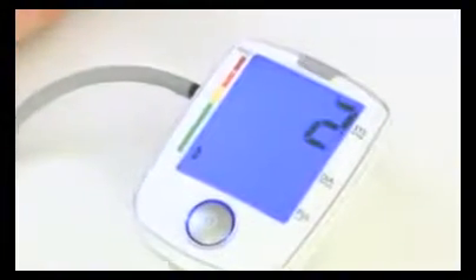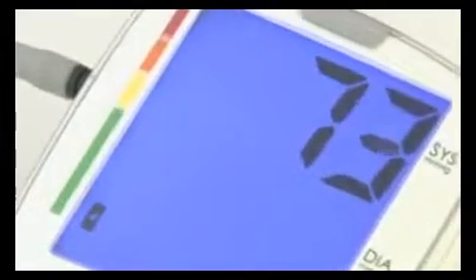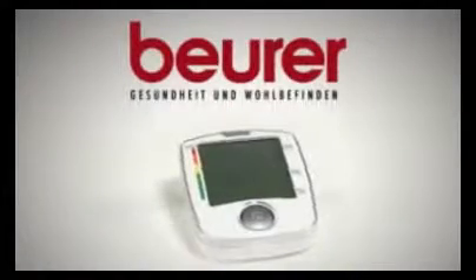The blue backlit display ensures the data is easy to read. The device alerts you to critical data immediately and interprets the measurements according to the WHO guidelines. Furthermore, the BM44's arrhythmia detection reliably informs you of any irregularities in your heartbeat. Easy to use and safe.